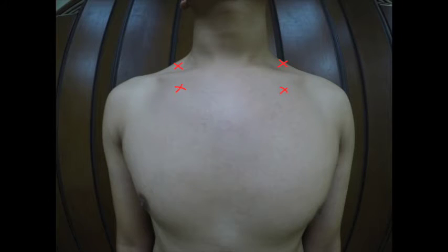Thanks, Kurt. Hi guys, I'm Utya, and for my part, I'll be doing the second part of auscultation, which is the breath sounds. Okay, so first, I'll be teaching you where to place the bell of the stethoscope during auscultations. When assessing for the apical segment of the upper lobe of both the right and left lung, immediately place the stethoscope above and below the clavicle or immediately lateral and below C7.